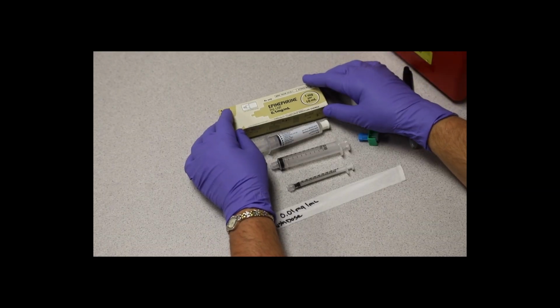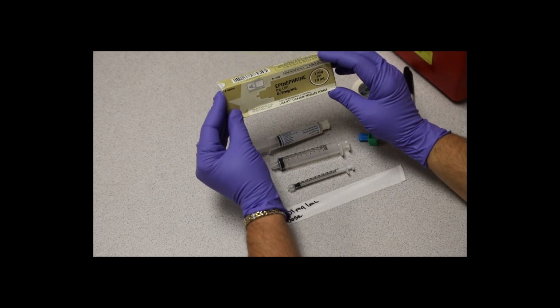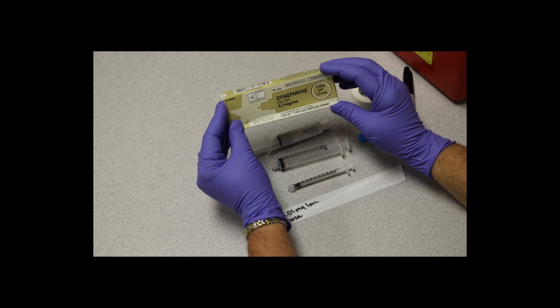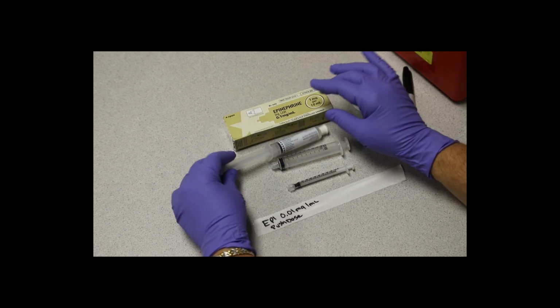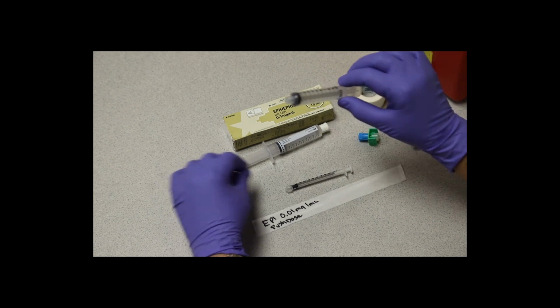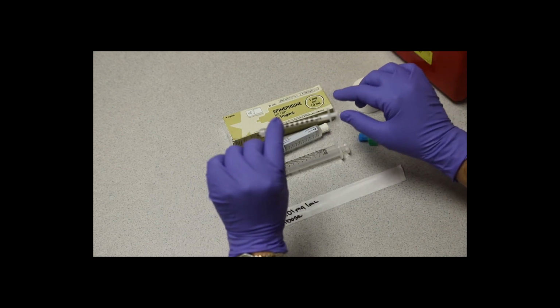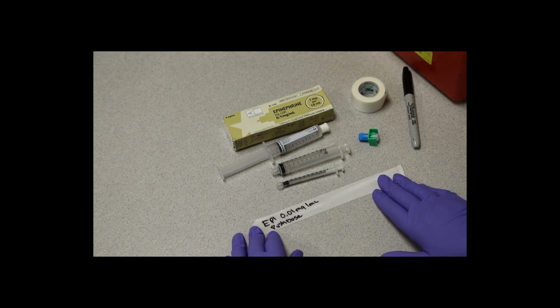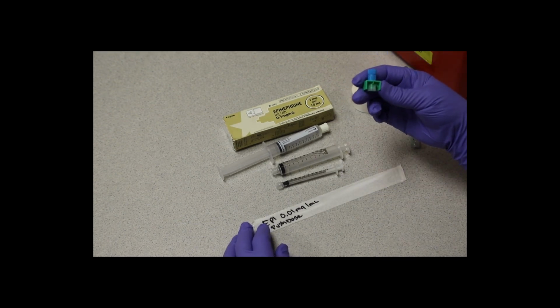You will need the following supplies: epi, 0.1 milligram per ml. You may know this by its previous labeling of 1 to 10,000. A saline flush, a 10 cc syringe, a 1 cc syringe, tape and a marker to make a label as I have done here, and a syringe to syringe adapter.